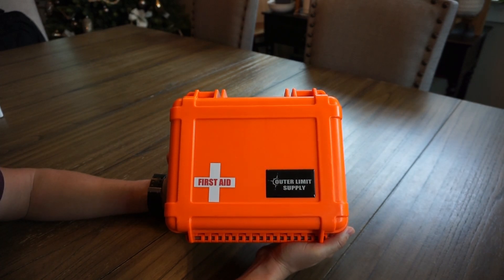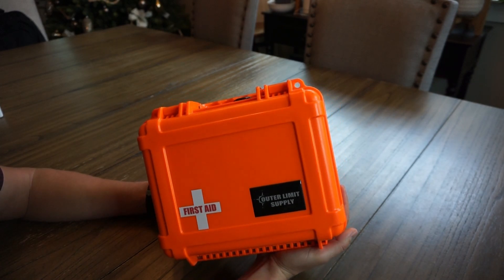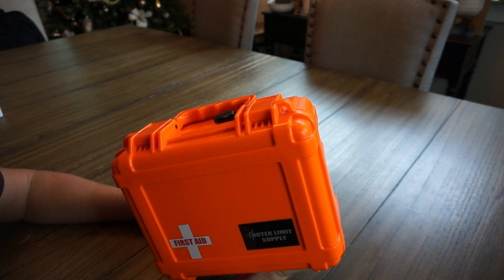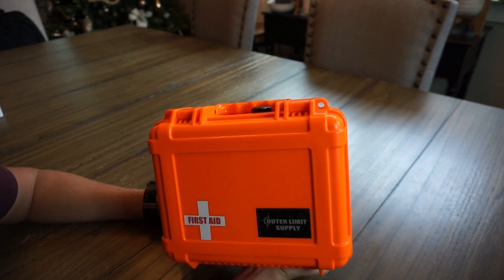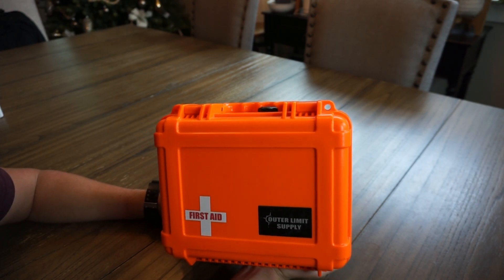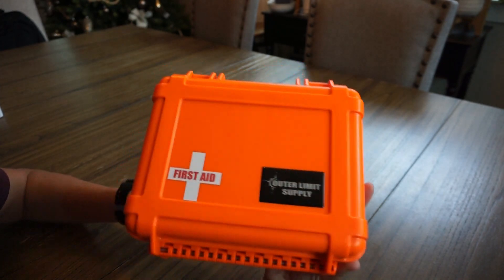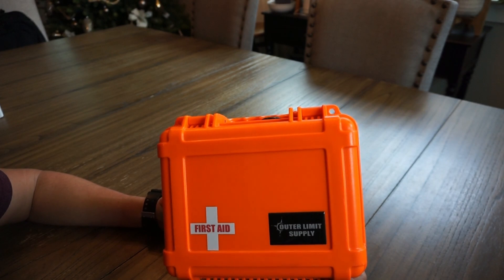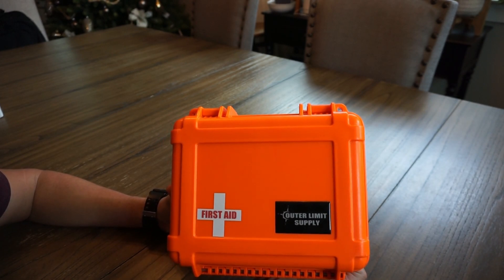Hey guys, this will be a quick video talking through some of the contents of this Outer Limit Supply First Aid Kit. It's designed to be a really convenient grab-and-go, heavy-duty and durable method of transporting this portable first aid kit. It's geared a little bit more towards outdoors, camping, and off-roading type things.